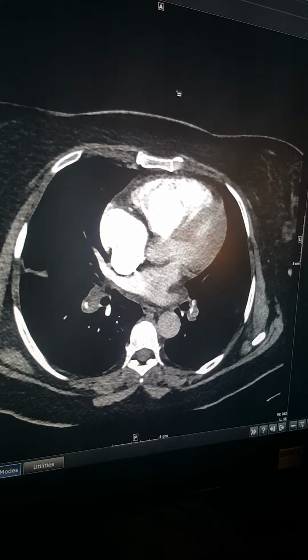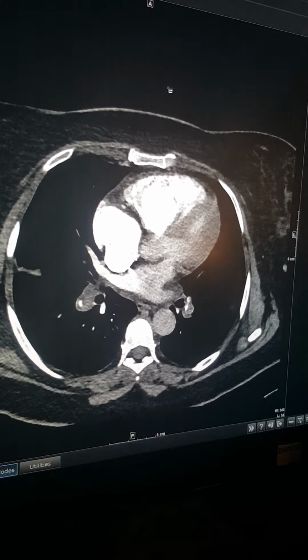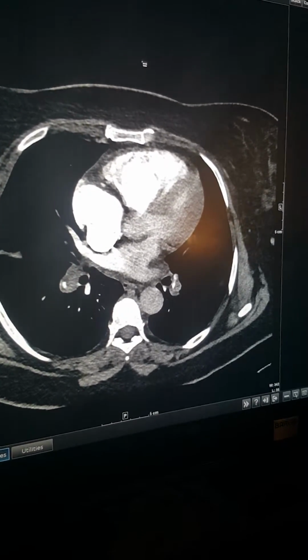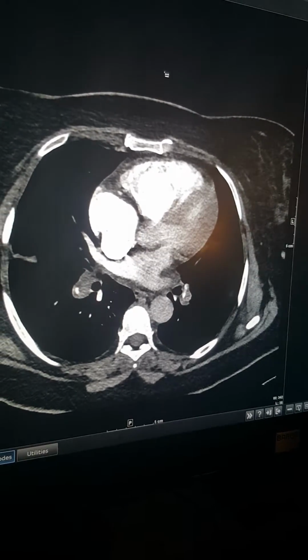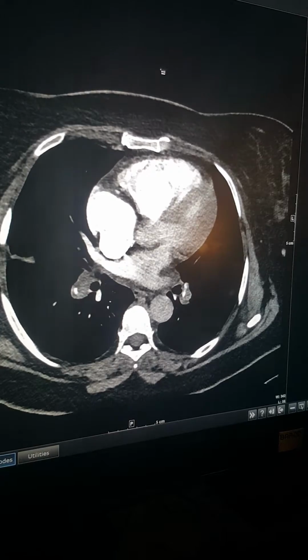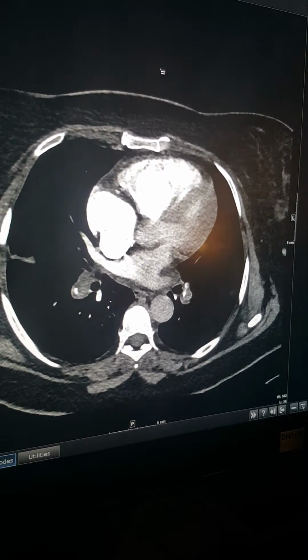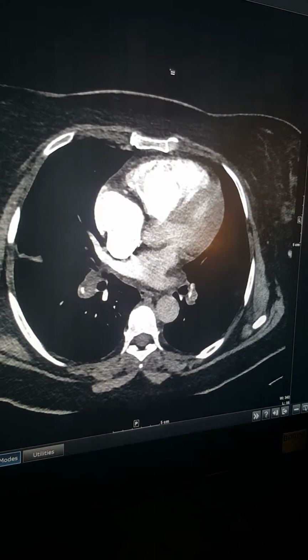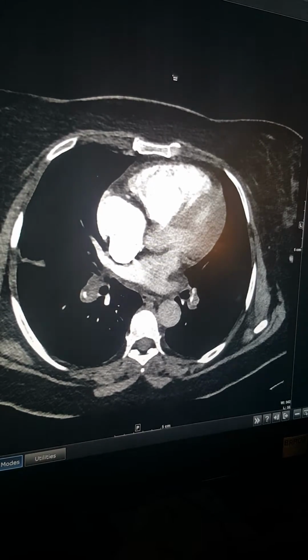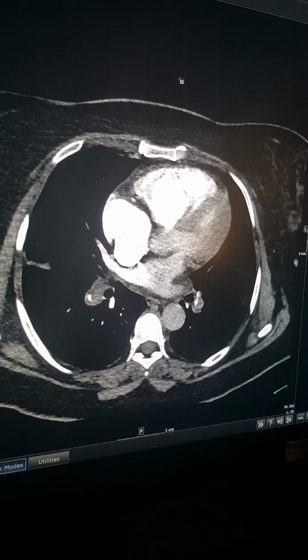Excellent. So can you just quantify what the radiation exposure to a pregnant patient is from the chest X-ray, the CTPA, and the new technology of CTPA? Yeah, if you utilize the optimal low dose strategy in a CTPE, you will actually get about 0.8 millisieverts, and even down to 0.5.